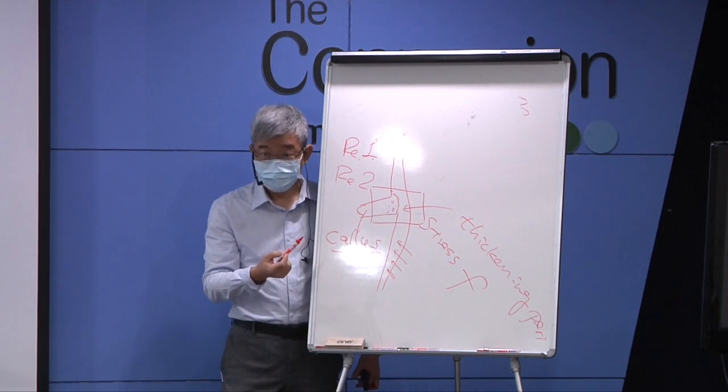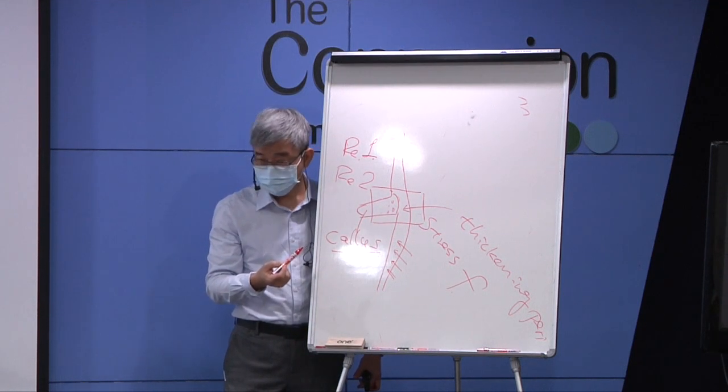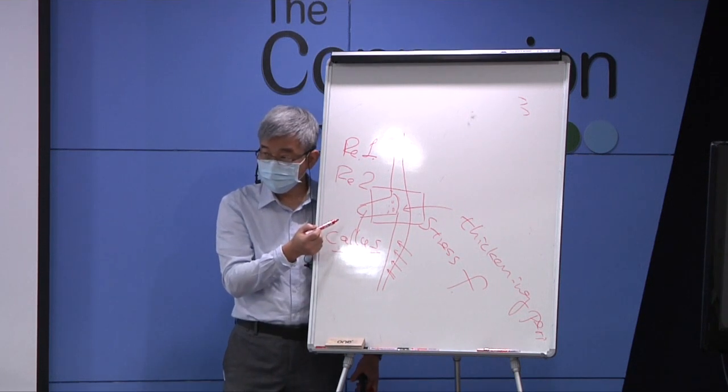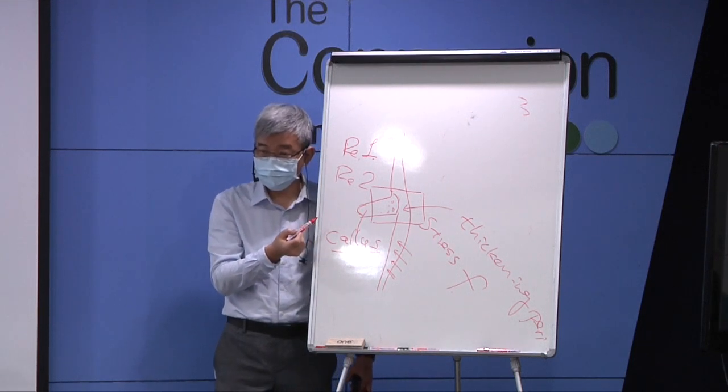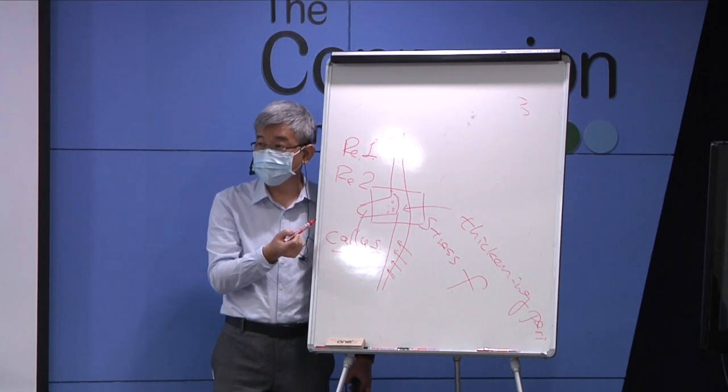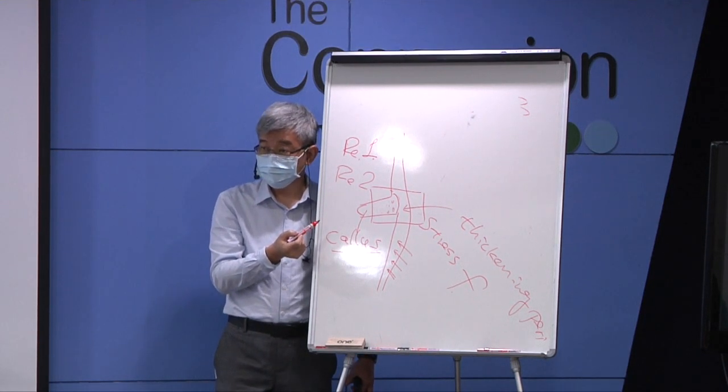So now, with the ultrasound's help, we can probably start the weight bearing, partial weight bearing exercise 1 to 2 weeks earlier than before. Okay.